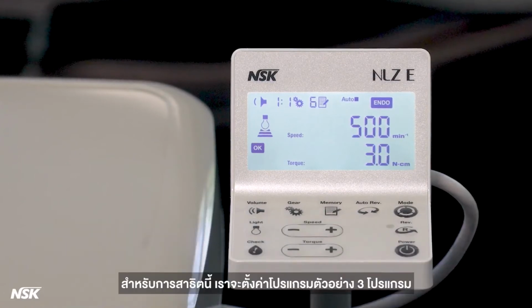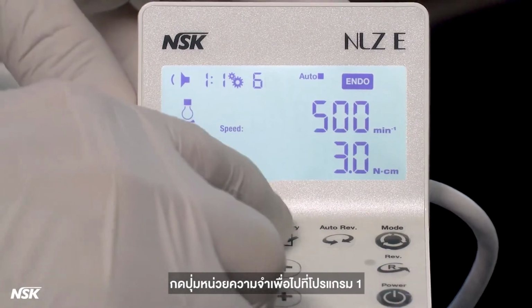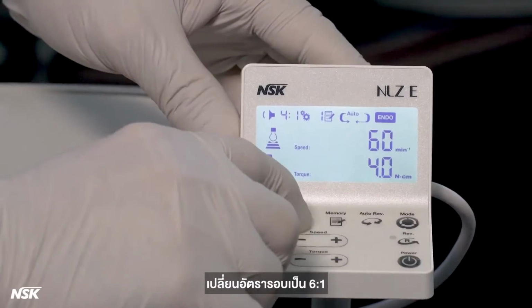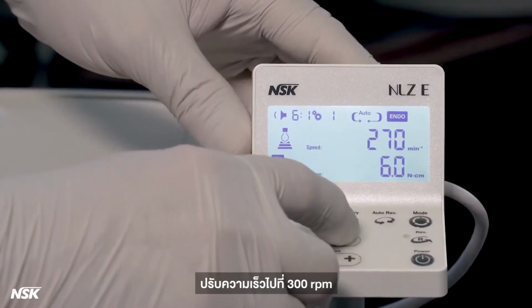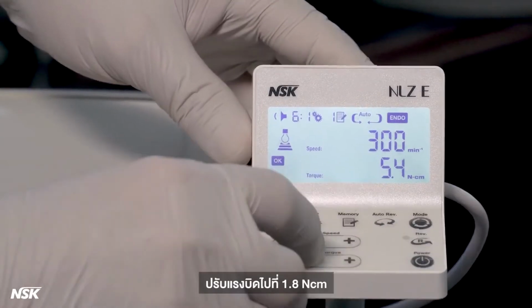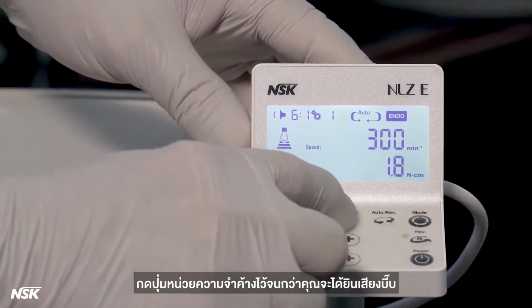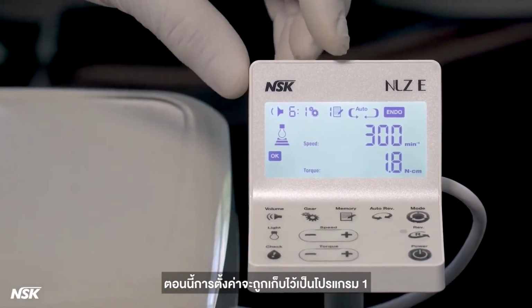For this demonstration, we'll set up 3 sample programs. Press the memory button to go to program number 1. The screen displays program number 1. Change the gear ratio to 6-to-1. Dial the speed to 300 RPM. Dial the torque to 1.8 Newton centimeters. Press and hold the memory button until you hear a beep. Now the setting is stored as program number 1.